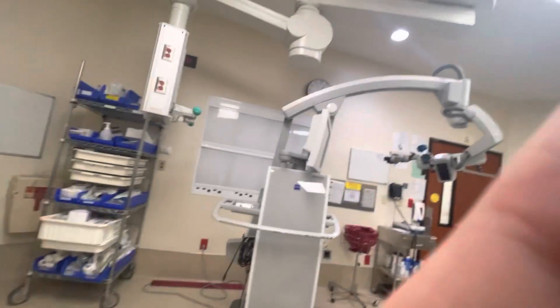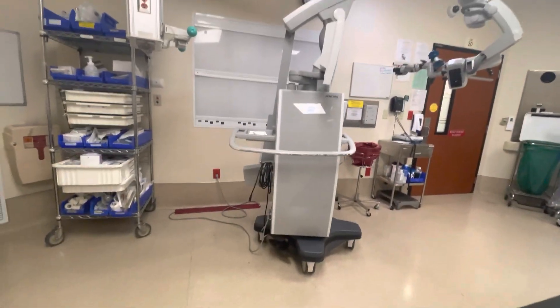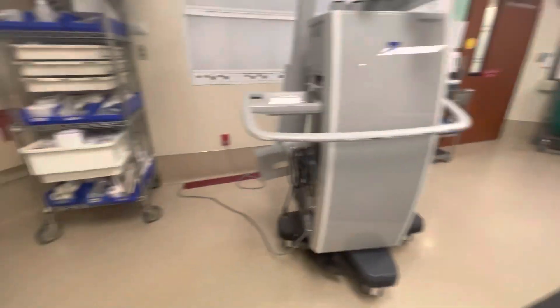Hey, this is a quick guide on how to set up this Zeiss Pentero microscope, mostly for otology cases and sometimes for head and neck cases. I'm early into the room, so I'm going to go ahead and set it up. It takes about five minutes total.